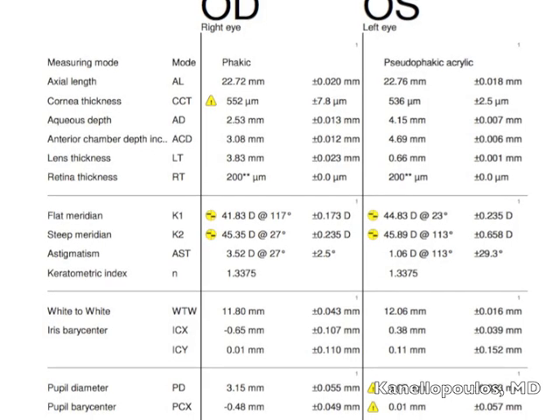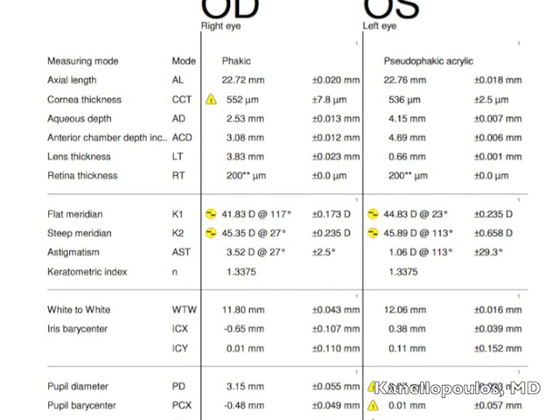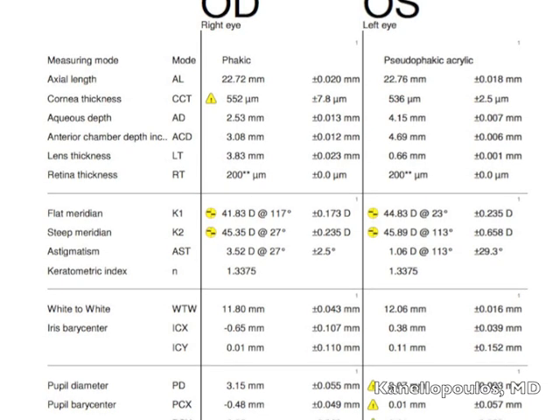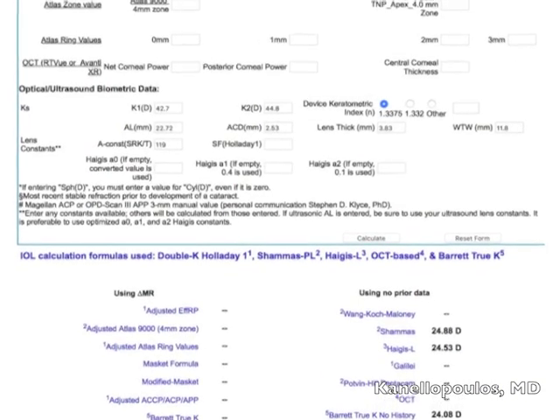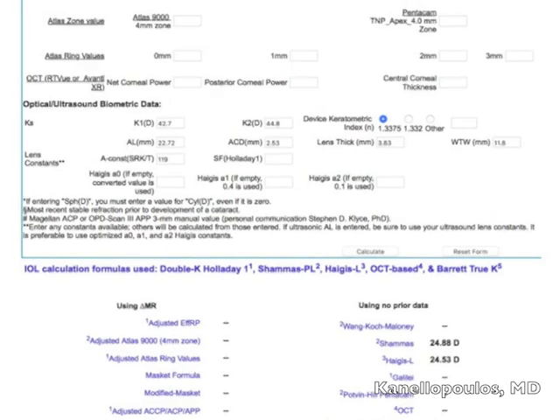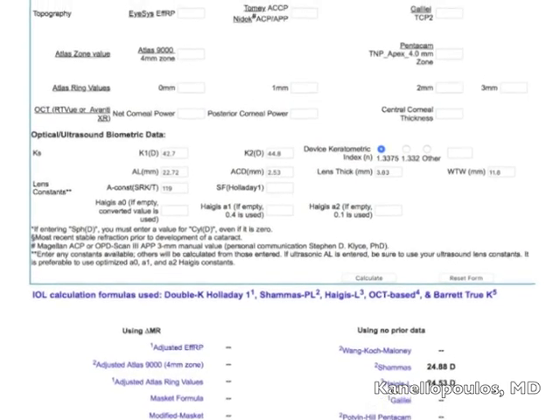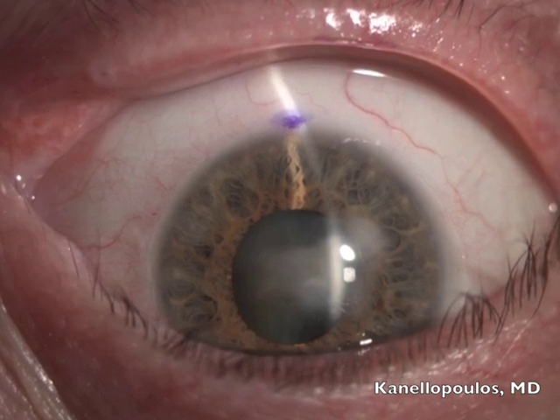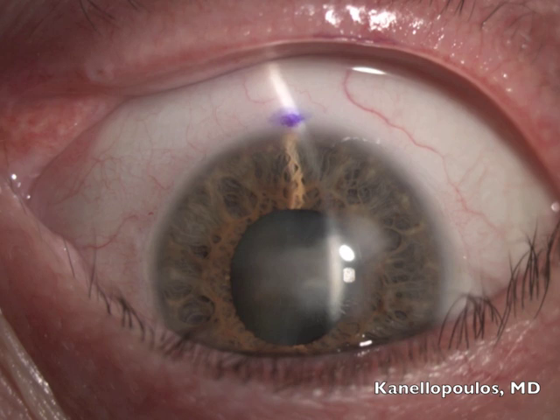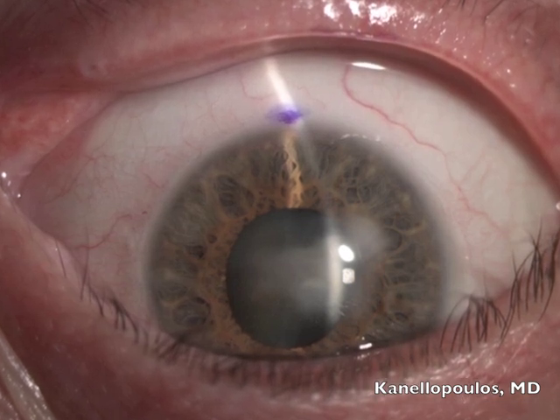You can see the left eye lens is just 0.6 millimeters. The right eye is almost 4 millimeters with a cataract. And we're going to use the ASCRS calculator for post-refractive surgery to calculate this lens because of the significant central flattening due to the scar. This is now our 6 o'clock marking seen here, which is seen upside down. We show it in the OR to orient ourselves, and I use that for my toric IOL marking.